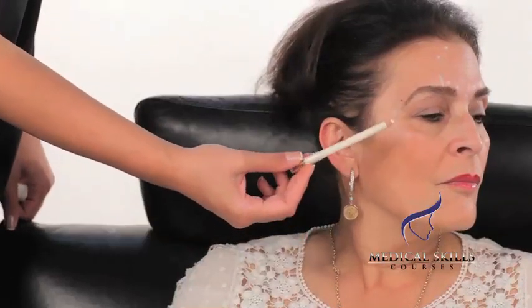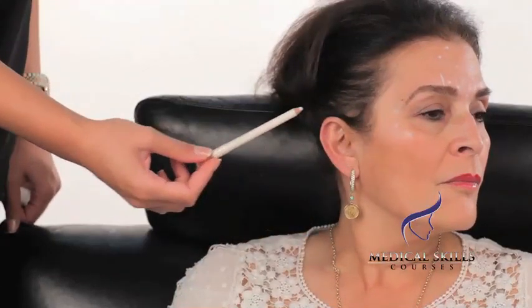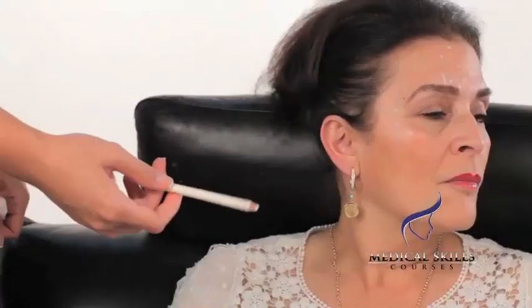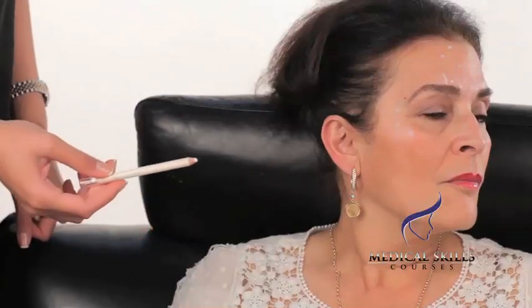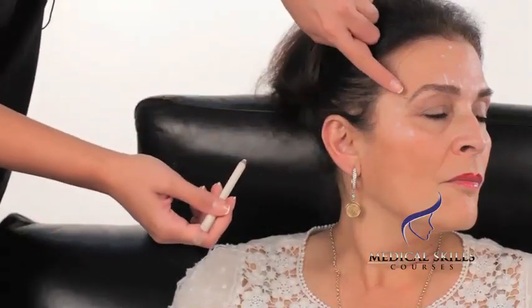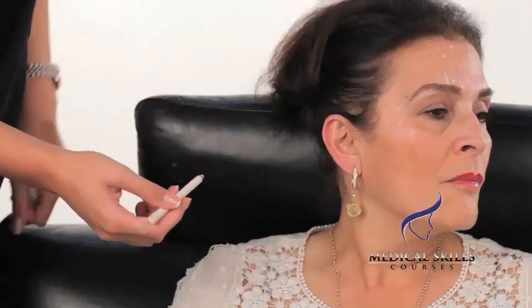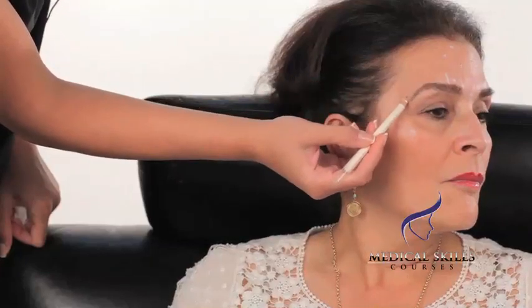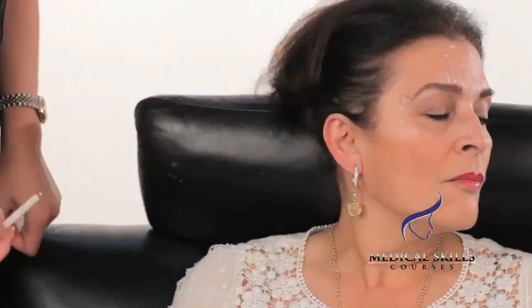When injecting the periorbital region, these three injections are standard. The doses advised are five units at the central injection, 2.5 units at the upper injection, and 2.5 units at the lower injection — identical doses on the other side. In this particular patient, she's also requested a brow lift. So what we're aiming to do is lift the tip of the eyebrow very slightly by placing one further injection at the lateral tip of the eyebrow — one to one and a half units on each side.